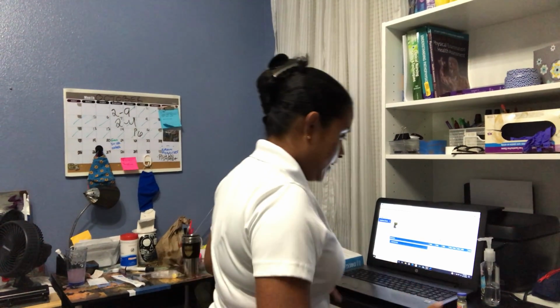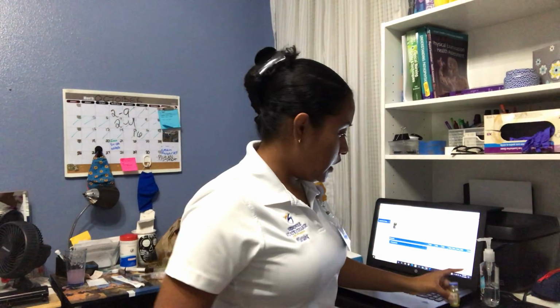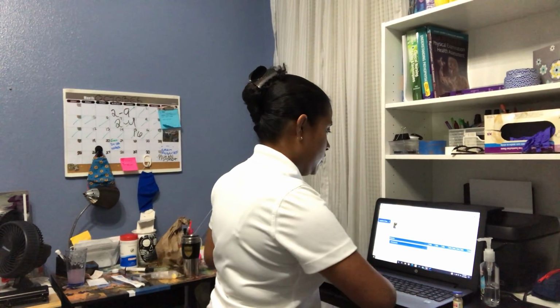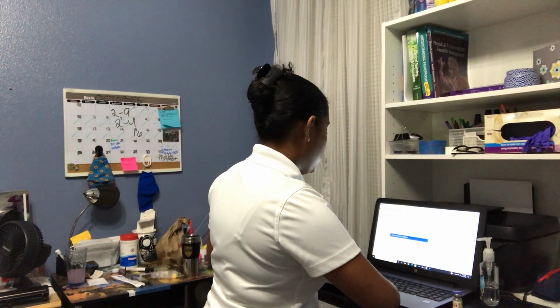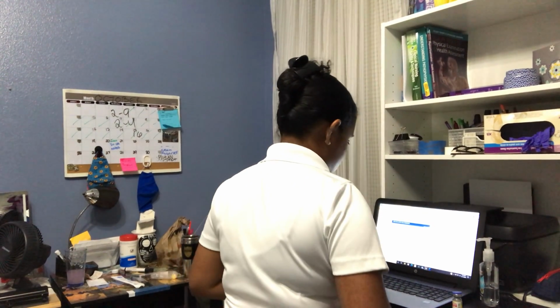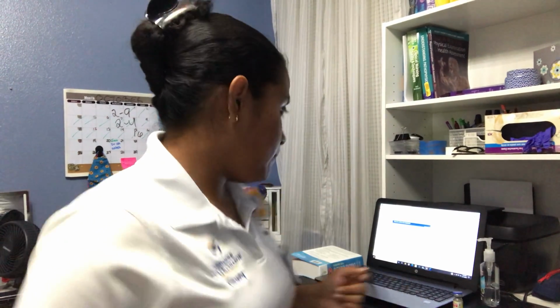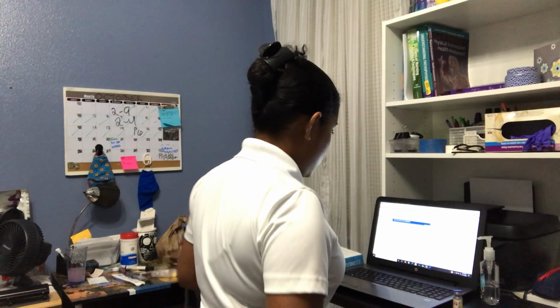Now that I've done that and I've calculated the medication, I know what I'm looking for. Now I'm going to look for what type of subcutaneous injection location I'm going to use. I'm going to use the anterior aspect of the thigh since the patient has enough adipose tissue. The anterior aspect of the thigh can take 1 milliliter of insulin, and the needle is an estimation of 1/2 to 5/8 inch, and the gauge is 25.